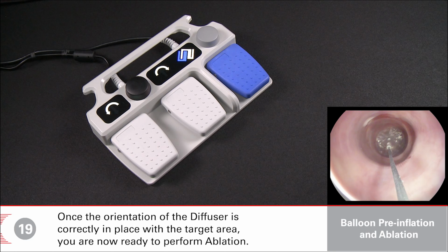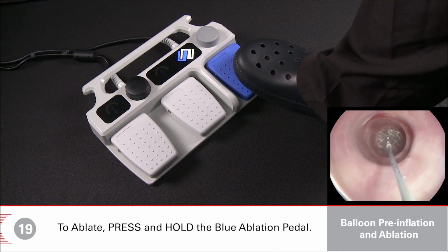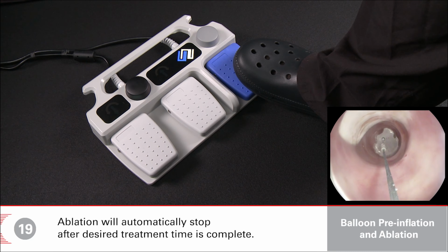Once the orientation of the diffuser is correctly in place with the target area, you are now ready to perform ablation. To ablate, press and hold the blue ablation pedal. Ablation will automatically stop after desired treatment time is complete.